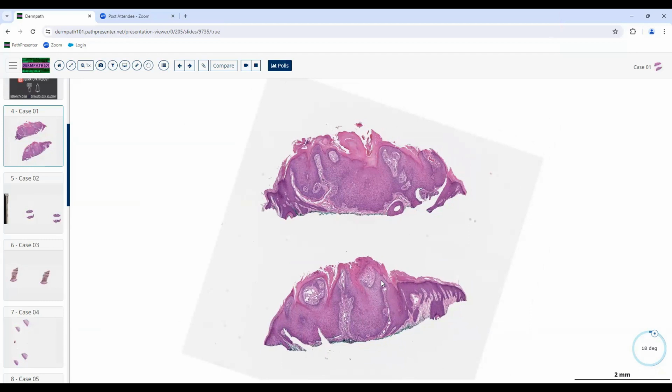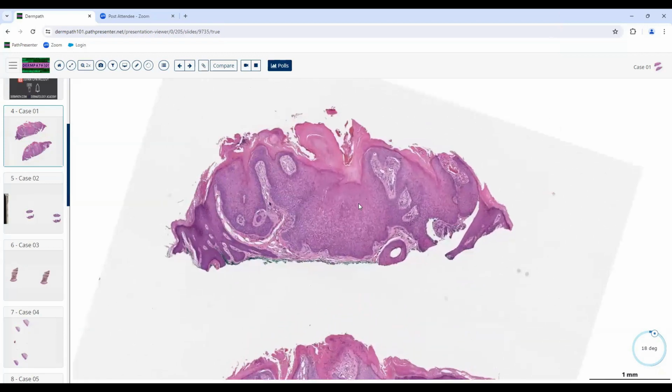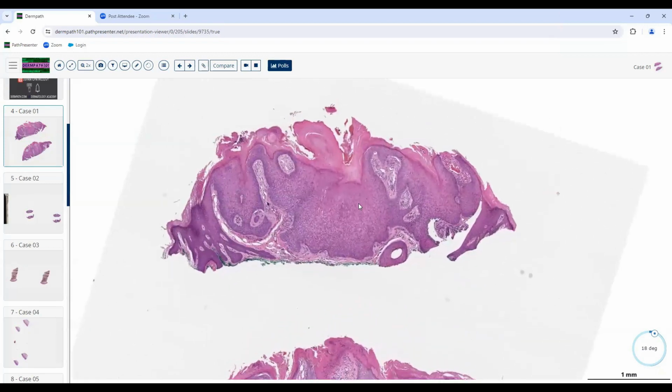All right, so here we have a shave of a papular lesion. I noticed that there's a lot of acanthosis, or thickening of the epidermis. There's maybe some parakeratosis or crusting at the top. The surface looks papillomatous, and overall it looks pretty well defined. I was noticing the collarettes of scale retaining all of it. So I favored neoplasm, likely benign from this power.